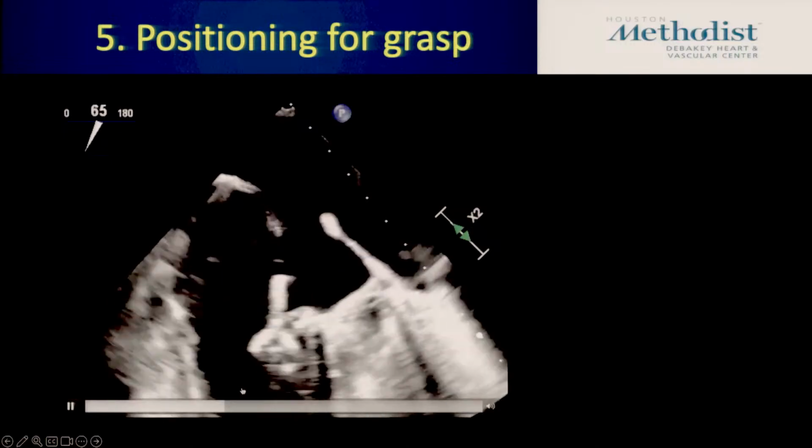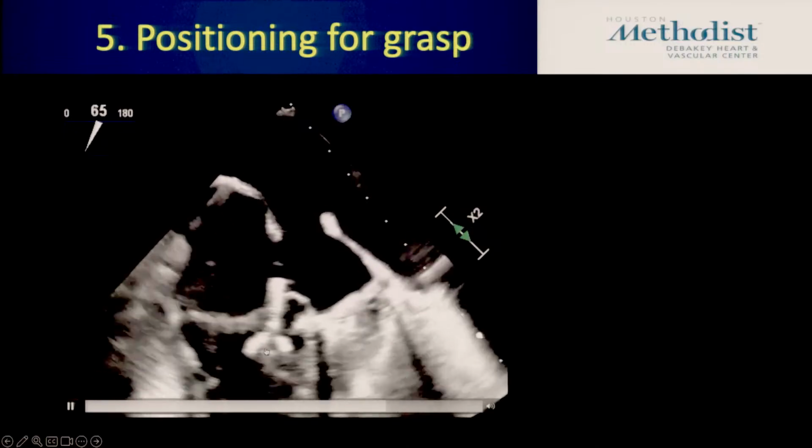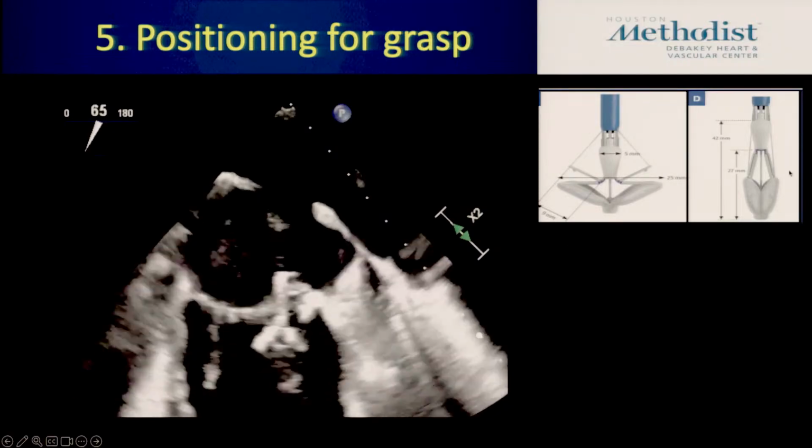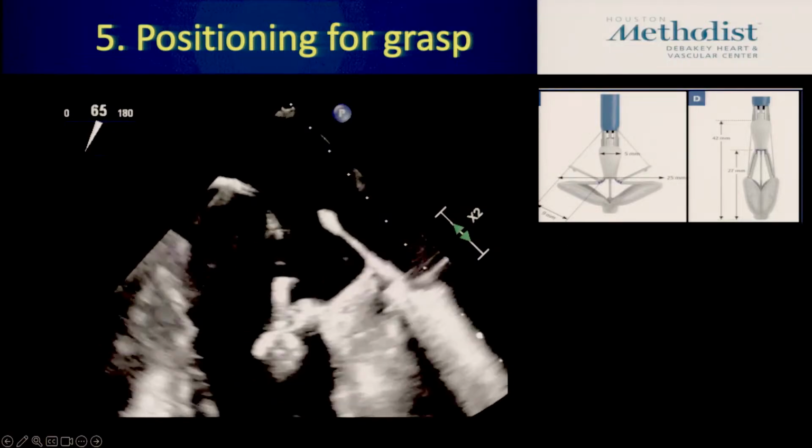This is an example of what it looks like everted with a slight entangle concern. And this is just that other device showing how it can be elongated to sort of get out of that position.